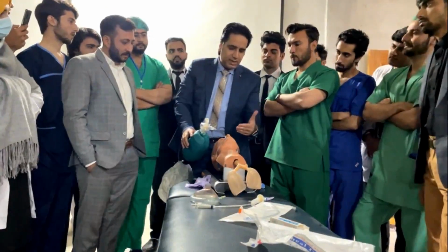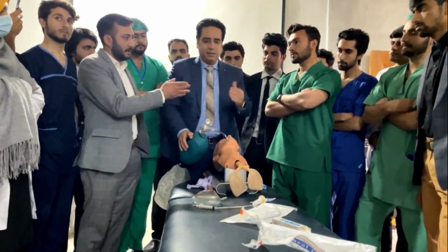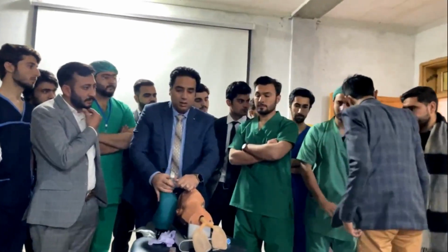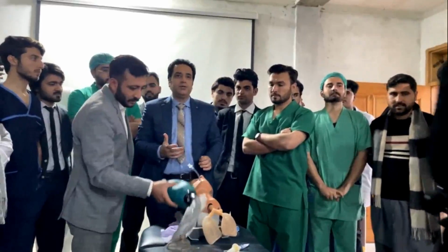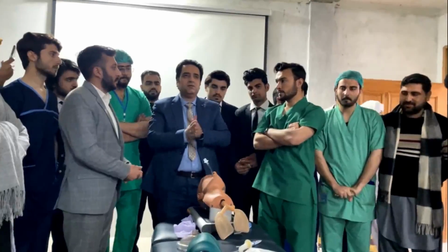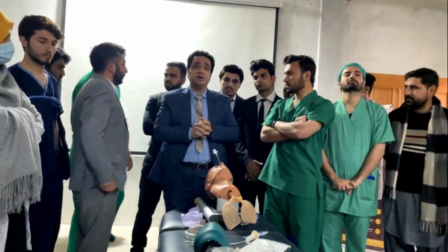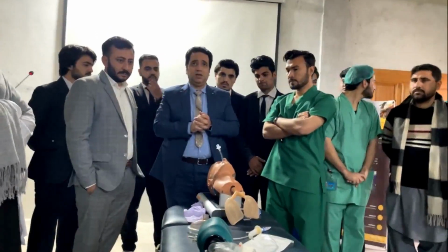So this is the basic thing about difficult intubation, the things you may face while intubating a patient. It was written at the start of the lecture that anesthesiologists have nerves of steel.